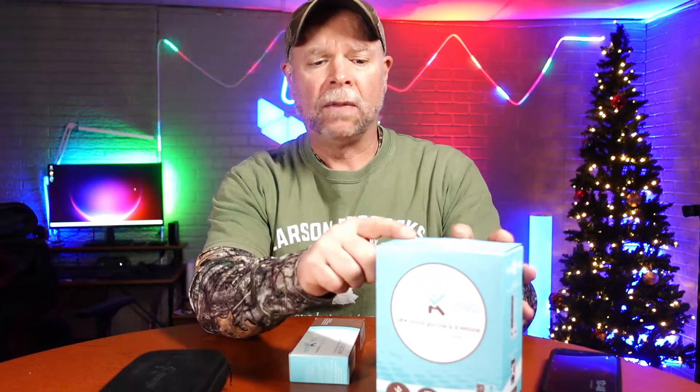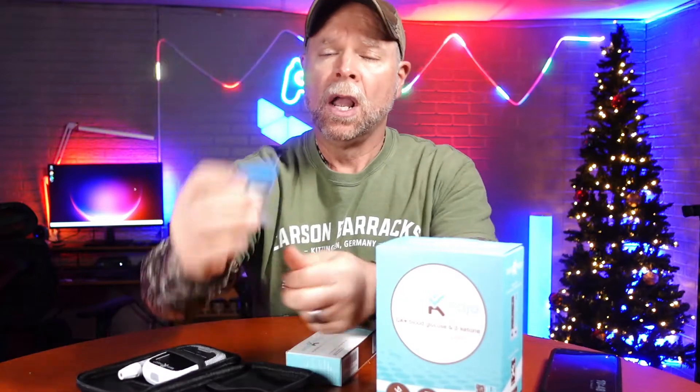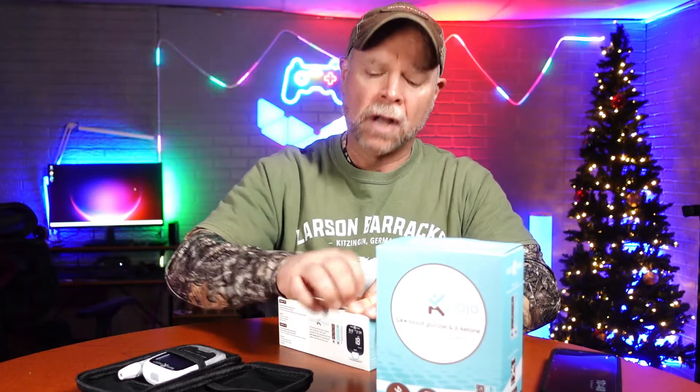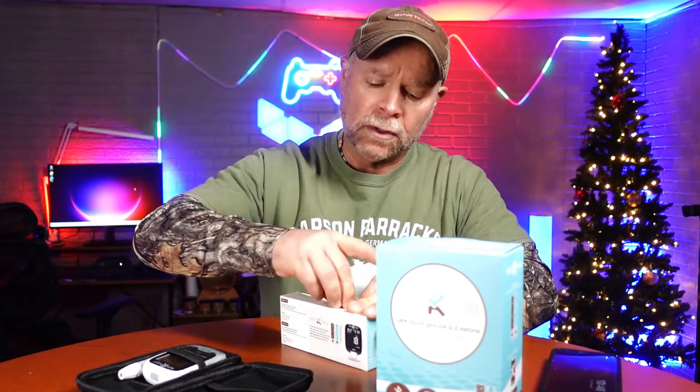What you get in the box is your monitor. You also get a finger prick and the prick needles. You also get a box of your test strips. When you order from Amazon, you're going to get 20 test strips of the glucose and 20 of the ketones. You can also order separately and get a box of 60. But when you order the monitor, you're going to get your test strips and your finger prick needles.